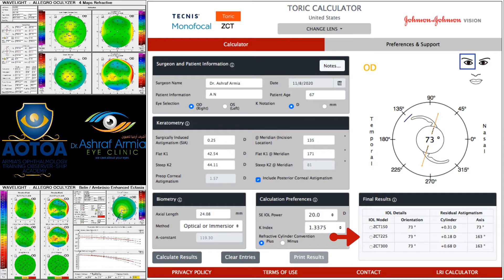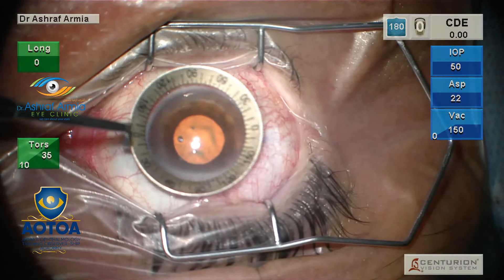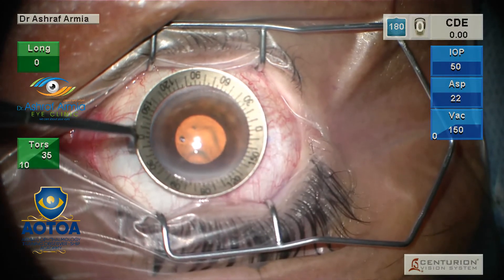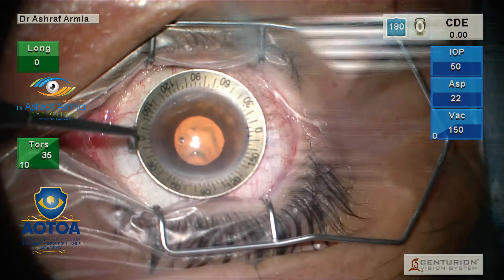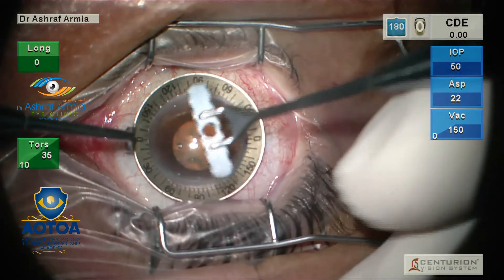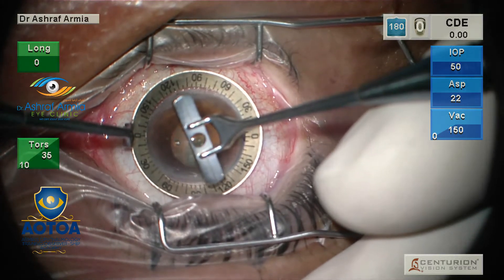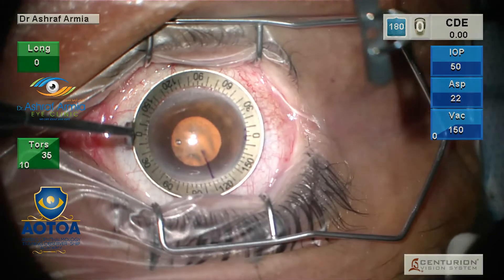The toric IOL I used is a Technist Toric — I used the T225 to correct the full astigmatism for the patient. During the operation, you mark the 0 and 180 degrees, and I always mark the steep region where my phaco wound will go, even when doing a toric IOL.